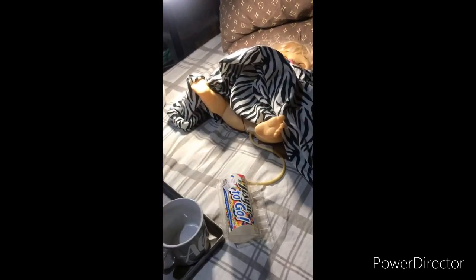Record type and size of the catheter. Record amount of fluid used to inflate balloon. Characteristics and amount of urine communicates pertinent information to all members of the healthcare team. Evaluation: residual urine measured, sterile urine specimen obtained, catheterization performed using sterile technique, retention catheter inserted without difficulty, bladder emptied when patient is unable to void.